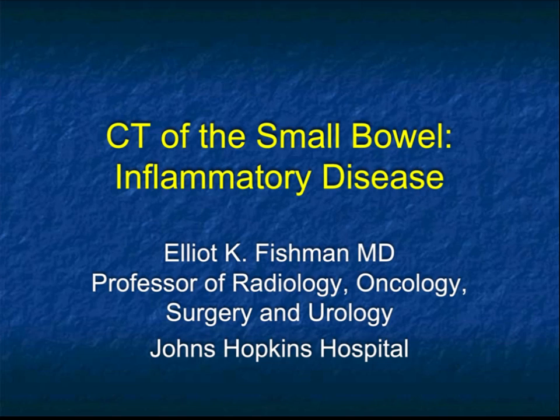And this is going to be on inflammatory disease of the small bowel. What I'm going to do in this talk is talk to you about some of the classic small bowel diseases, like Crohn's disease, but then go into some of the more unusual ones we don't think about, but are seeing more on a daily basis. And some of those might be considered drug-related inflammatory bowel disease. So without further ado, let's get started and let's see what we can talk about.